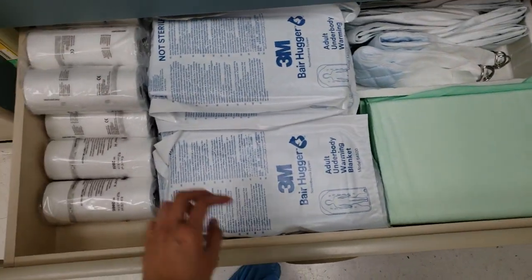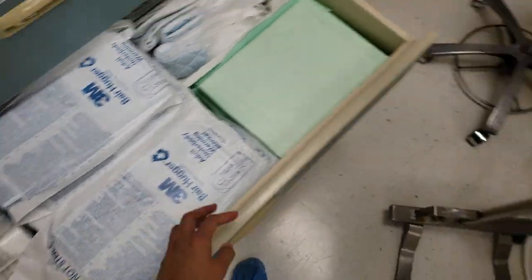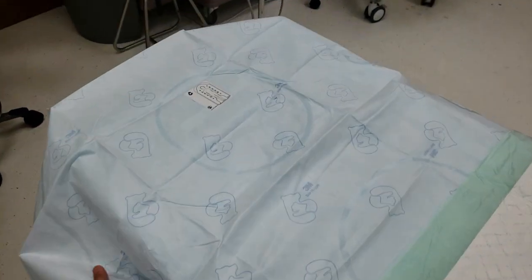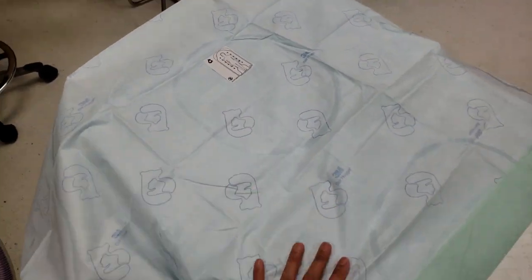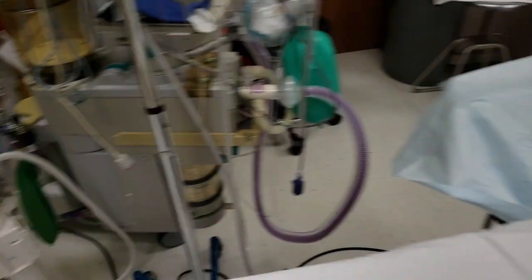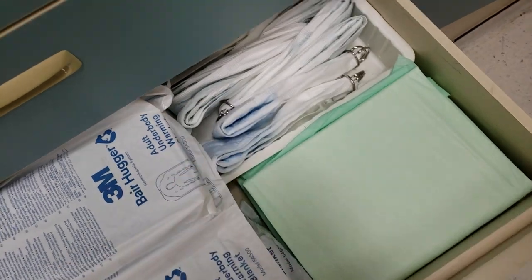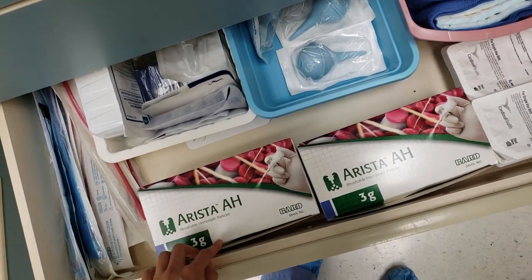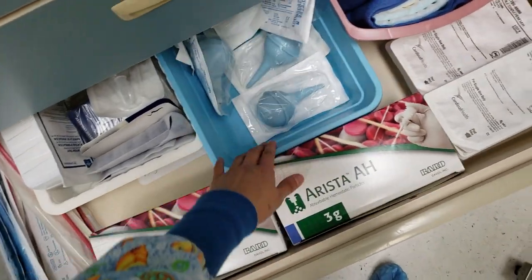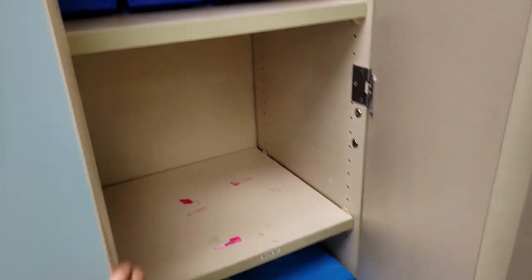And we have here some Medipore tape, a Bair Hugger that goes on the table, so it looks like this. That's the orientation of how you should put it. This basically hooks up to that machine and it warms up the patient. And then you have some pads here, and this goes to the candy cane stirrups when they do D&Cs. And then some random stuff here, some Arista. This is a hemostatic agent, and some bulb syringe, and this is actually a staple remover, which we don't really use here. And then in this cabinet, it's pretty messy.